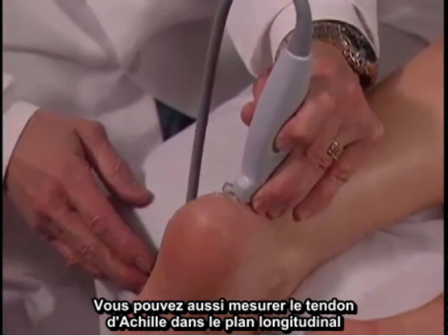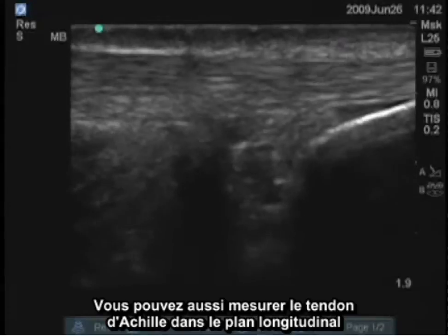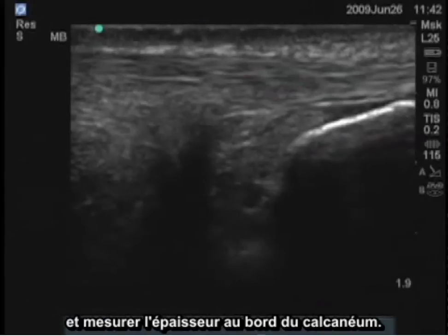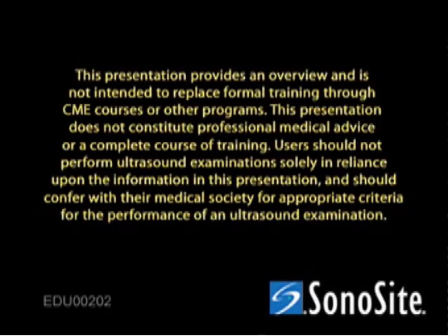You can also take measurements of the Achilles tendon in the longitudinal plane and measure the thickness at the edge of the calcaneus.